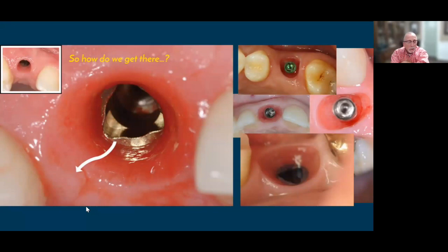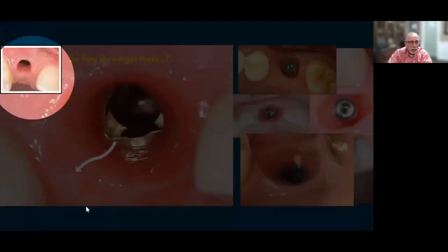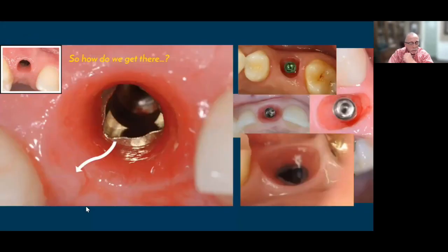So, when I talk about tissue, right? So many cases I would see came up with just a straight tissue punch over the implant, and good healthy tissue, great impression. I can see everything clearly, and the request was, make us a crown. So we kind of had to come up and out of that narrow hole of tissue and then flare out to make the restoration. And that's, honestly, where the problem lies.